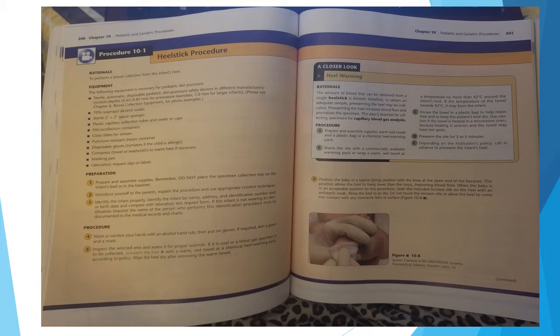Please see Chapter 6, Blood Collection Equipment, for photo examples. 70% isopropyl alcohol swabs, sterile 2x2 gauze sponges, plastic capillary collection tubes and sealer or caps, micro collection containers, glass slides for smears, puncture-resistant sharps container, disposable gloves, non-latex if the child is allergic, compress to warm the heel if necessary, a marking pen, laboratory request slips or labels.